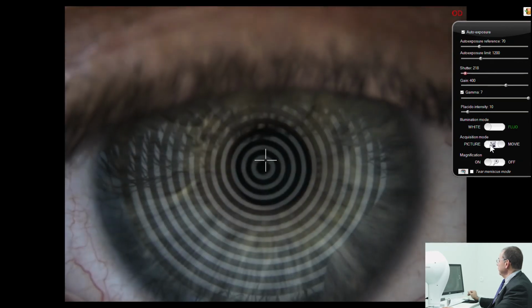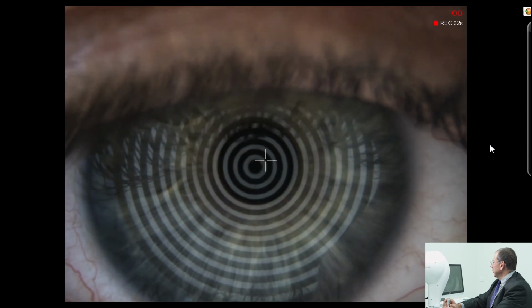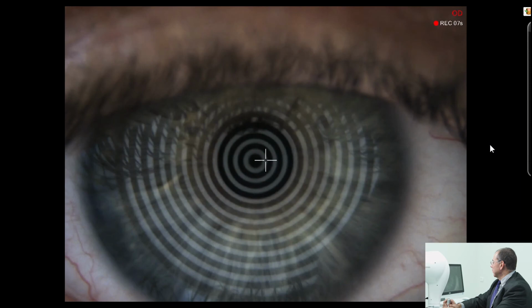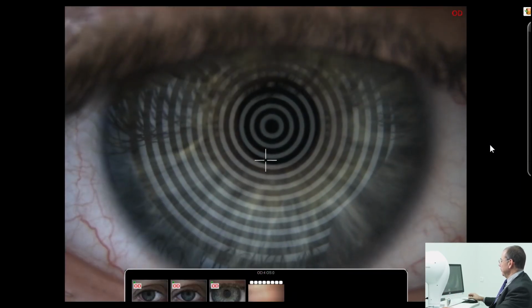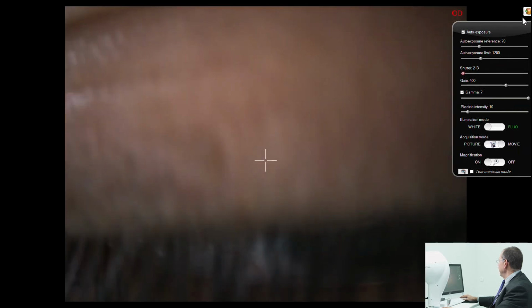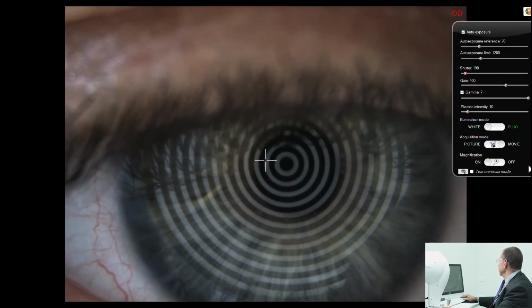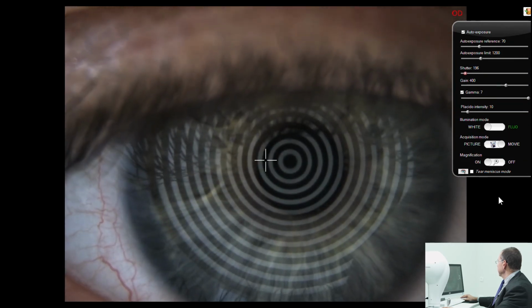If we go to movie mode, we can start the movie. The movie is recording, and why don't you blink? Move a little bit to the left, a little bit to the right. Okay, that's great, and we can stop the recording. So all of these we can do. You'll notice that when we're doing a function, this window jumps out of the way, and by simply placing the mouse over it, it will come back into the way. So we can then utilize it.